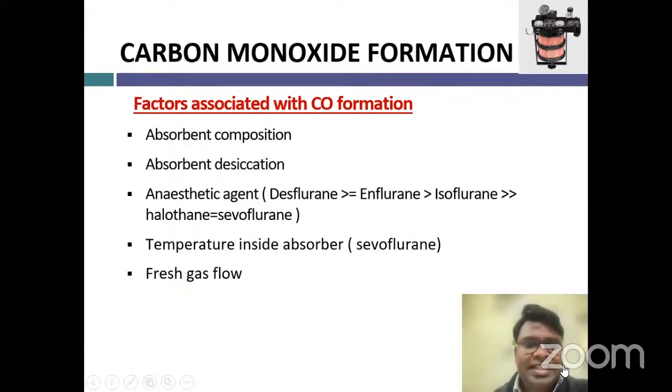High alkali desiccated soda lime is at greater risk for CO formation and compound A formation. Choice of anesthetic agent, temperature inside the absorber, and rate of fresh gas flow are other determinants of carbon monoxide formation.